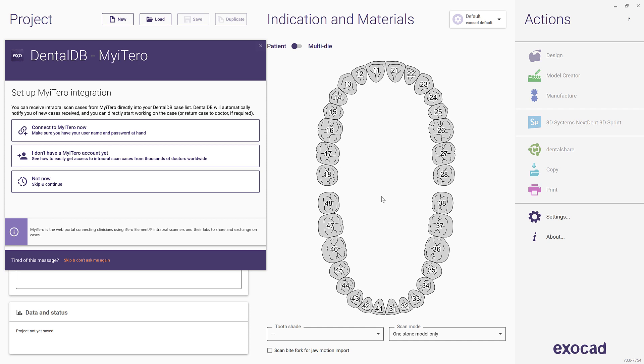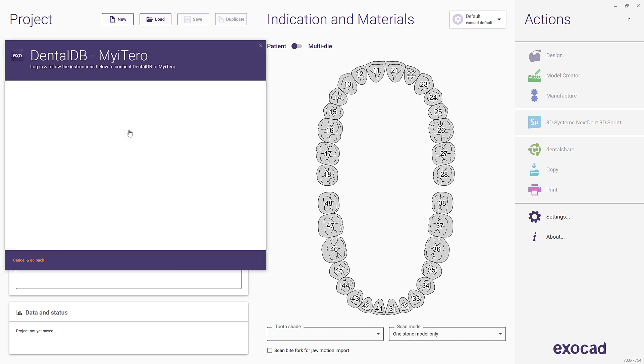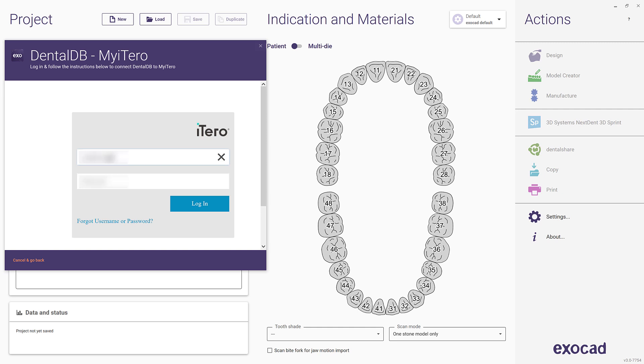As an ExoCAD user, the My iTero connector gives you an easy and integrated way to directly receive intraoral scan cases. To set up the My iTero connector, click Connect to My iTero now. You will be taken to a login screen where you can enter your My iTero credentials. Click Login when done.